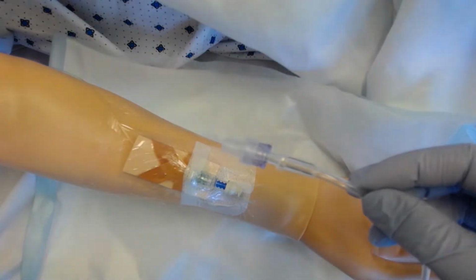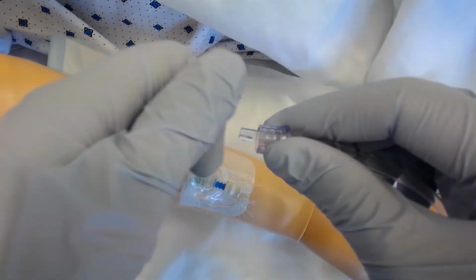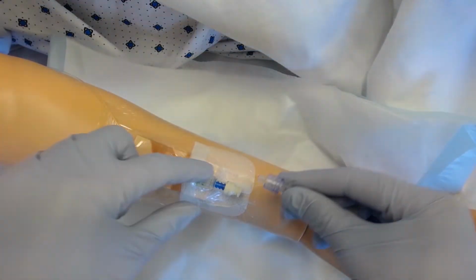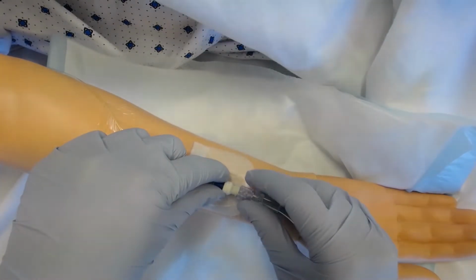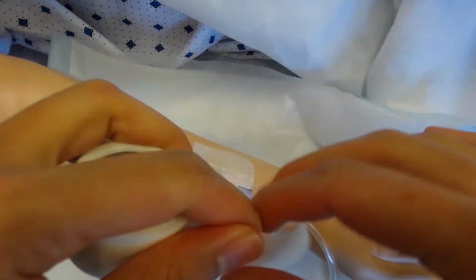Here's the patient end. I'm just taking the cap off now. And I go straight in to connecting that to the cannula. While stabilizing the cannula with your non-dominant hand, connect the IV tubing to the patient's cannula. Do so without contamination.